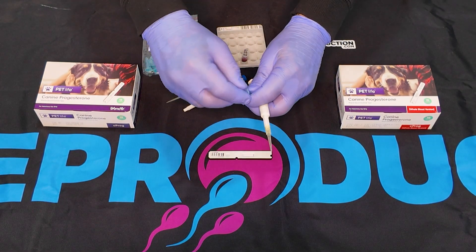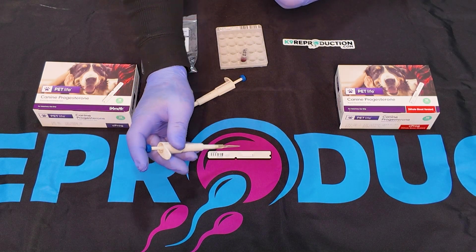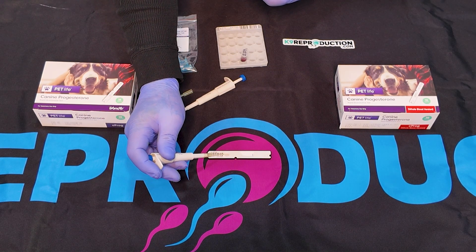Now apply 75UL of serum buffer solution directly onto the sample well of the test strip. It's crucial to avoid air bubbles during this step to ensure the test runs smoothly.